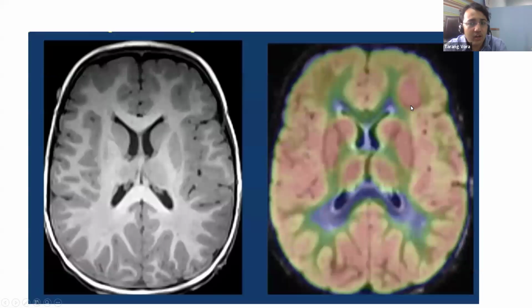And this is another FCD type 2A where we have this, and then we have some arterial spin labeling showing some area of hypermetabolism over there. Yes, arterial spin labeling is a good technique if we want to avoid nuclear imaging, but in our practice, we believe nuclear medicine, or the PET scan, provides much more definitive and more reliable data than the ASL.